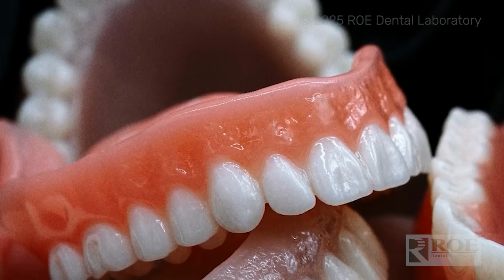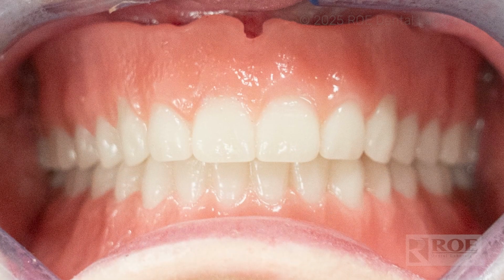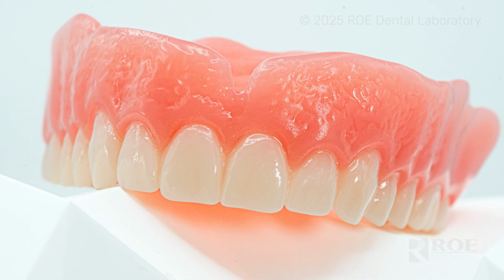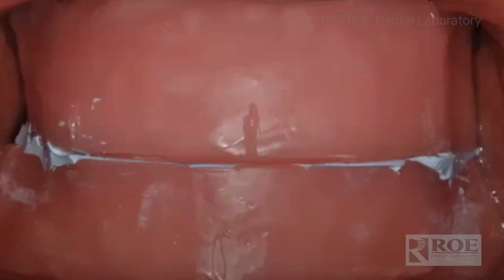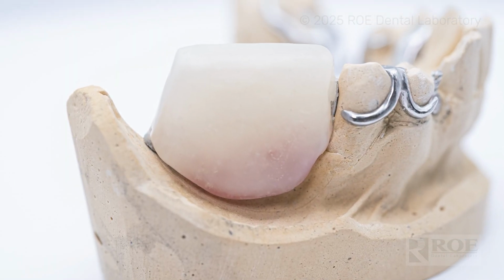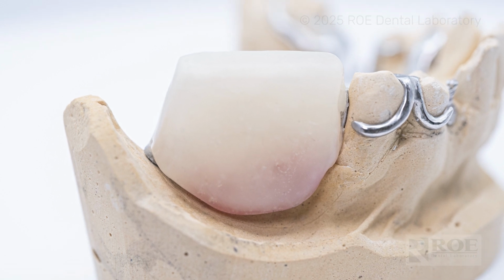So let's start off with the records you need to send into us for a digital immediate denture with analog records. Just like you would for a regular denture case, we need upper model, lower model, as well as a bite. From there, we can go right to a finished immediate denture, but if you'd like to work on the patient's VDO or verify anything to do with their opening, we can return a partial bite block to you for those edentulous areas if you want to go down that avenue.